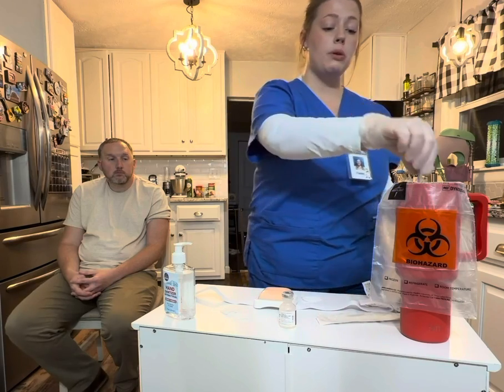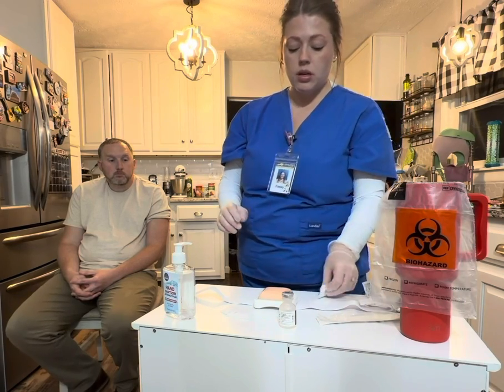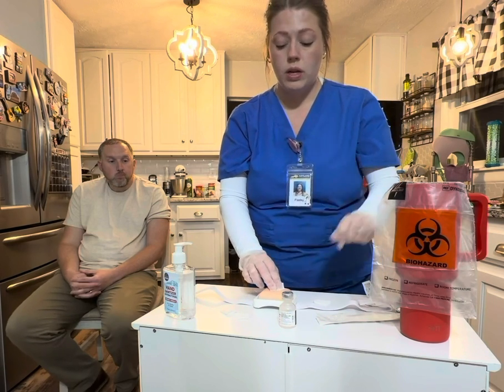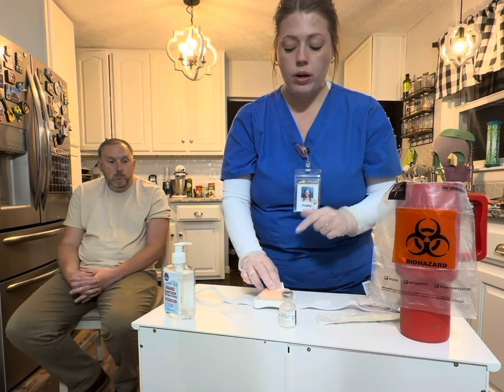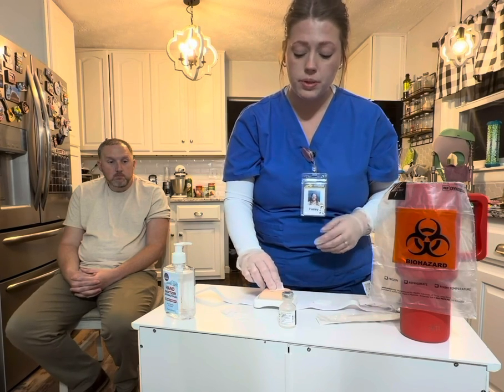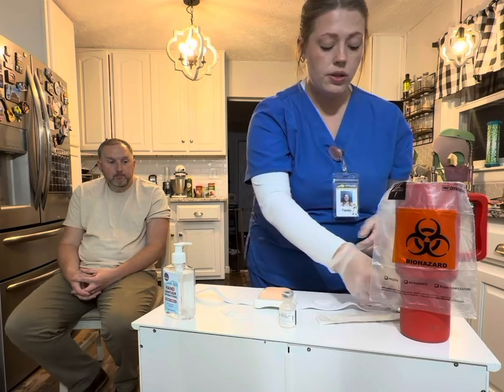Then we will immediately engage that safety and dispose of that in the sharps. We'll go ahead and apply some pressure, just making sure that we're not massaging it. And we're going to make sure that we just do that until the bleeding, if there is any bleeding, stops. And that looks good.